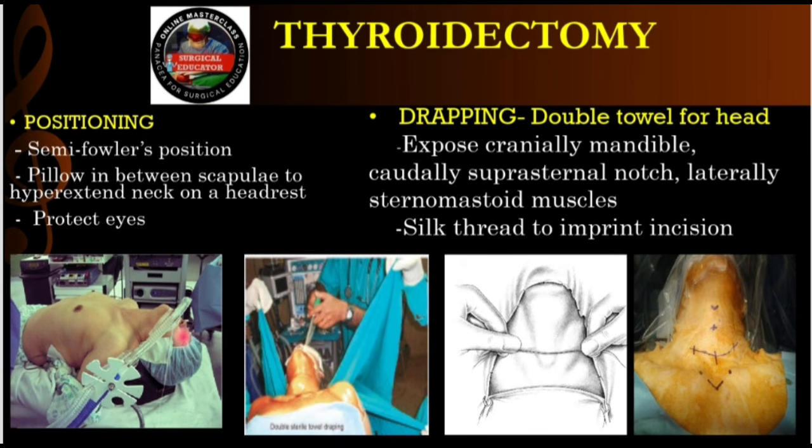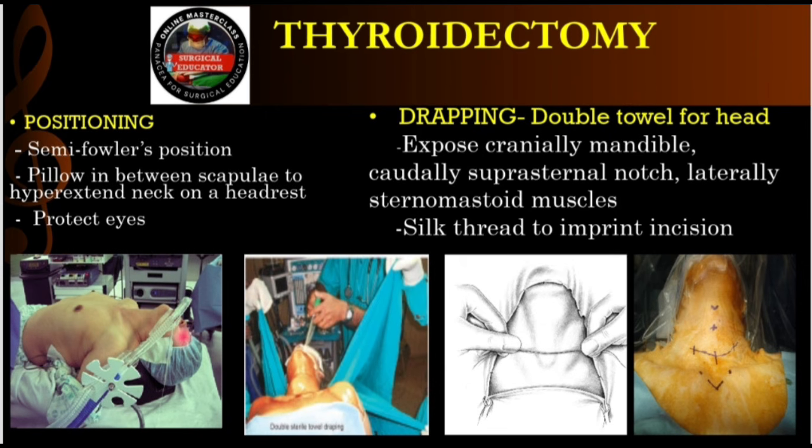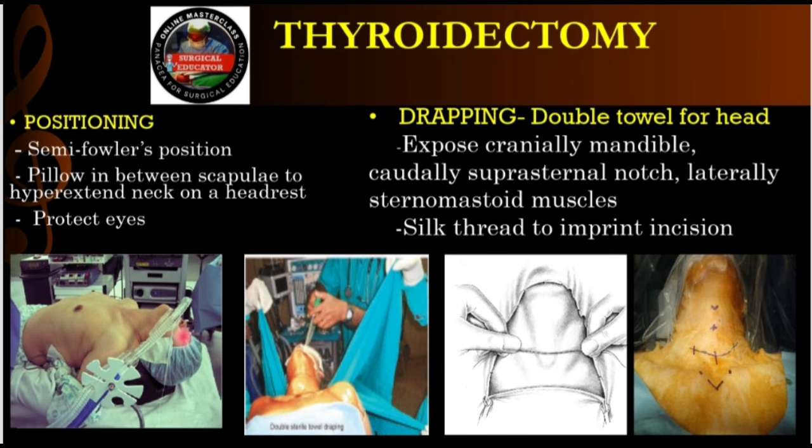Makes sense. And what about tilting the whole bed up 15 degrees? Why fight gravity? Well, actually, you're using gravity to fight bleeding. The veins in the neck, the jugulars, the thyroid plexuses, they don't have valves like the veins in your legs do. Blood flow there is completely dependent on gravity and chest pressure. By tilting the head up 15 degrees, you encourage all that venous blood to drain back down into the heart. Decompressing the veins. Exactly. They collapse. So when you make your incision, you're not instantly dealing with engorged, bleeding veins all over your surgical field. Such a smart mechanical trick.